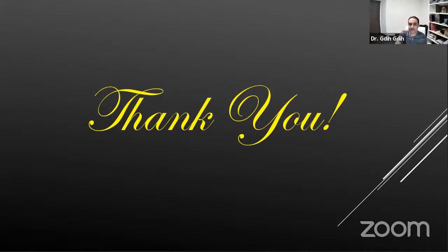Someone said, how about the fixation monitor, off and on? We answered that earlier. In my experience, yes, I do set it off. Someone asked, is it better to set it off? I do, because it's an extra tool to monitor for fixation losses, and it can give you a lot of unreliable fields, even though they are reliable. It can be a case of hypoplastic optic disc.